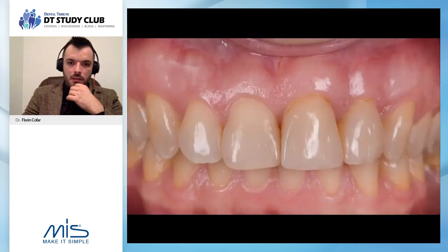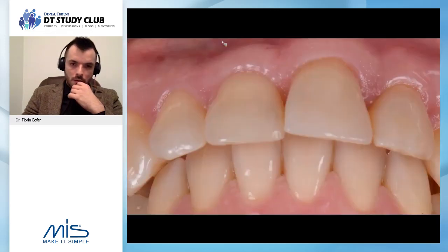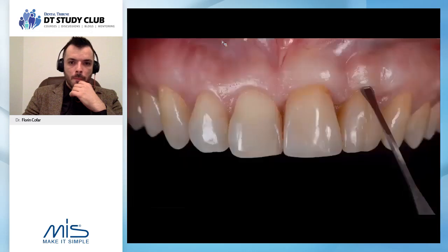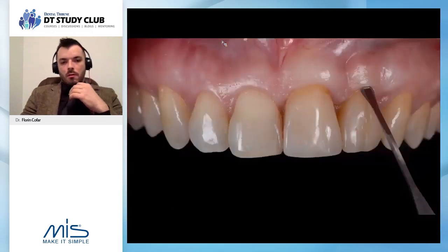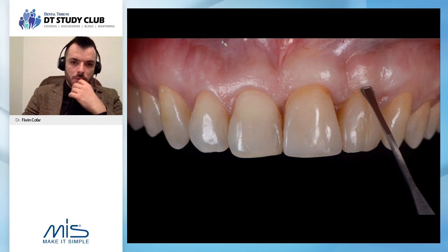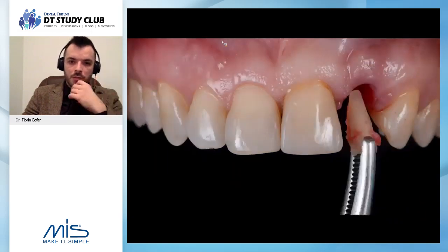So take this case for example. As you can see here, we have a failing lateral. You can also see we have a little bit of volume asymmetry. Now, the aim when we restore such a case is, first of all, to be minimally invasive, and second, to be as close to natural as possible. Gustavo Giordani was the surgeon in this case. The tooth was extracted, and you can see the root came in two pieces.